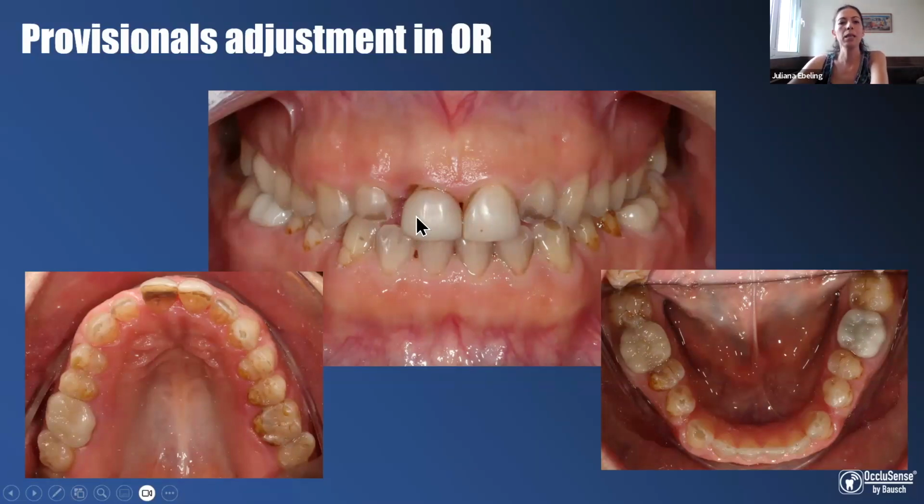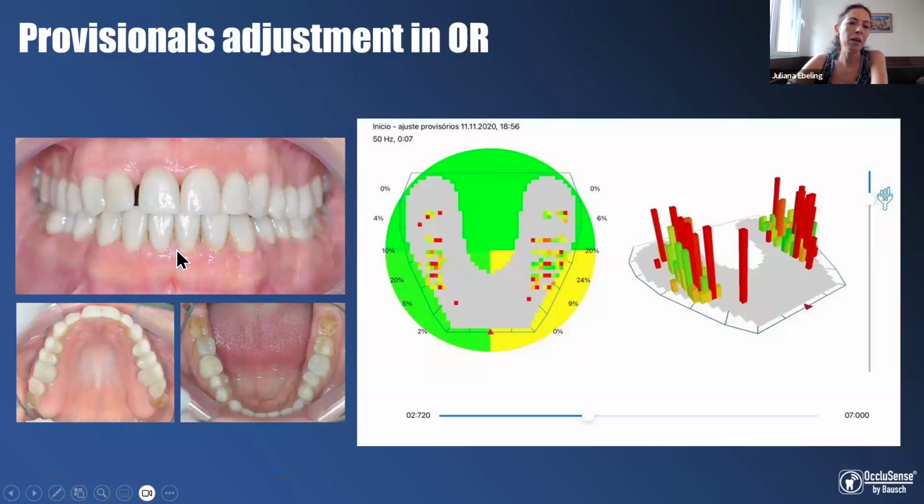But it's impossible to do an orthodontic treatment with this sensitivity and all this situation. So I planned a provisional phase to improve static, improve sensitivity, and give more structure for the movements, with no contacts in the anterior teeth, because I need to move these anterior teeth to a better position, while trying to give this patient a better balance to work during the movement.